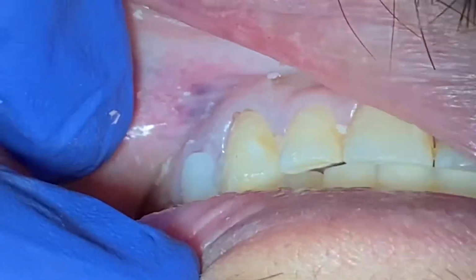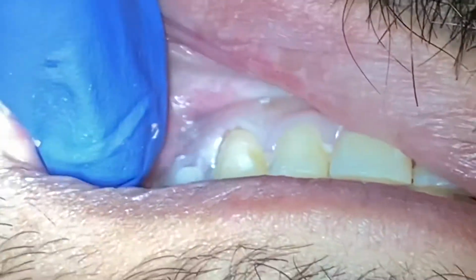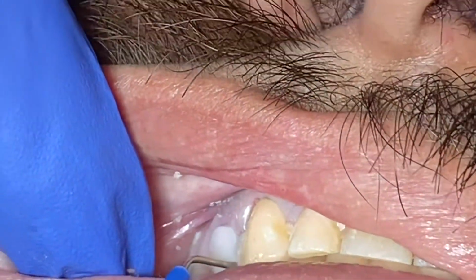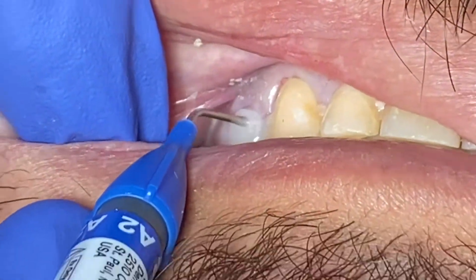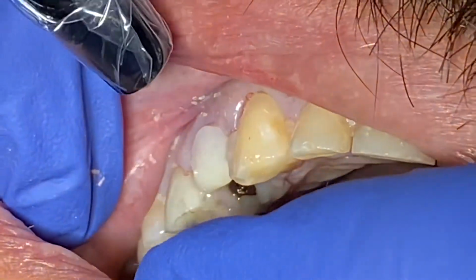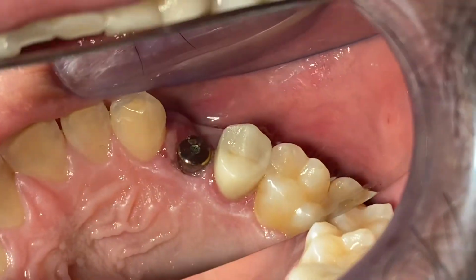So this is a temporary crown, half quarter temporary crown, no occlusion at all. And I told the patient, try to be gentle for 2 weeks to 3 weeks. If it comes out, I will just pretty much try to evaluate and see what the next step is. So this is the beginning, as soon as we take out the tooth, this is how it looked like. You can see that the soft tissue wasn't damaged at all.